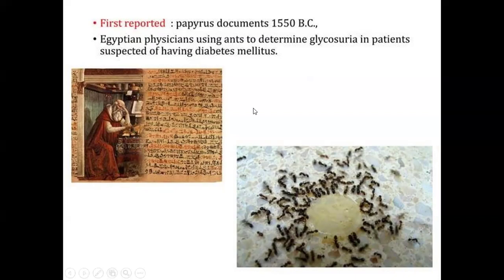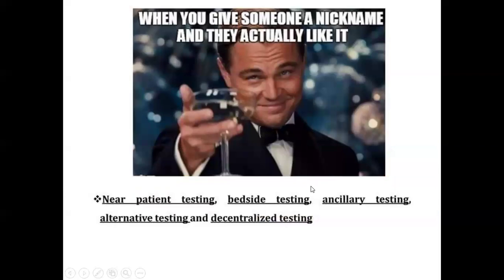So this is an ancient technology that is being used. This itself, you can tell, is point of care testing that is being done. This is a small example: when it is near your bedside, or you use point of care devices as an accessory on your body in the form of a smartwatch or a pendant or anything, that gives you a lot of ease.